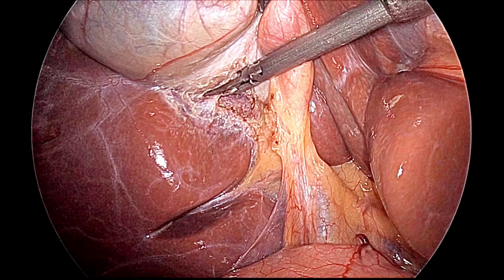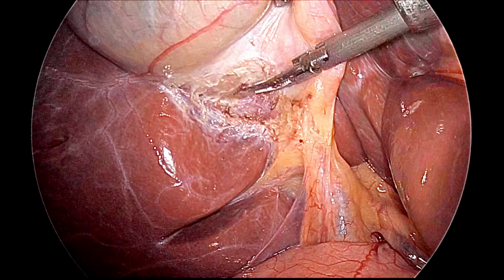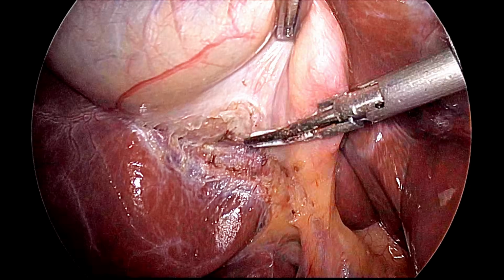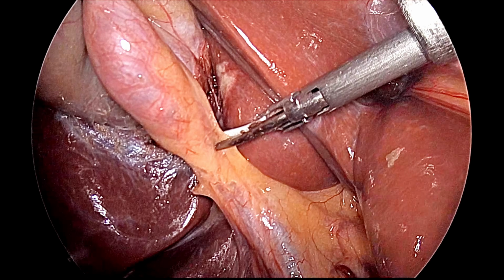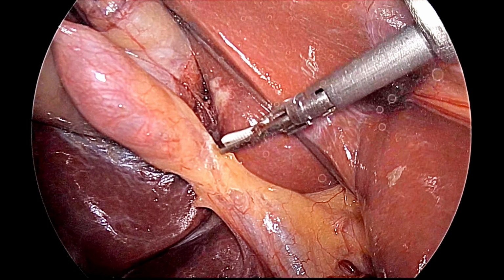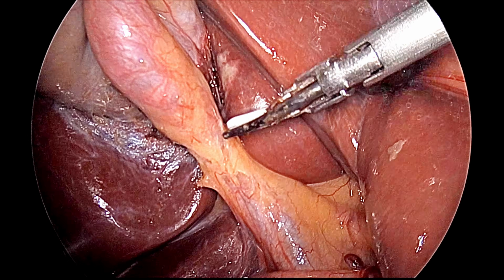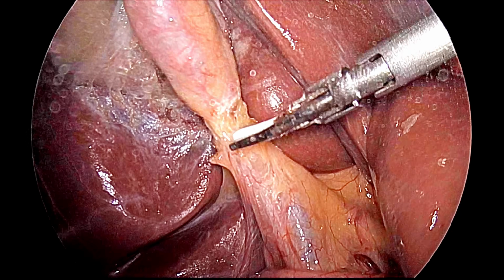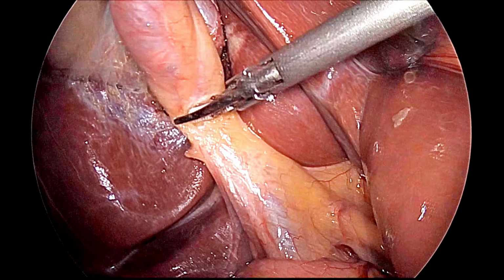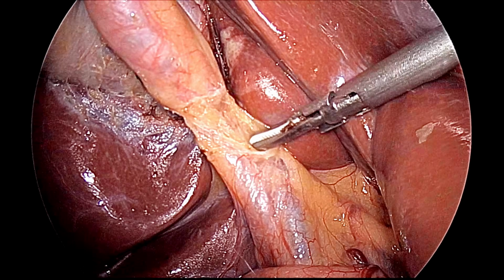We can see here the posterior window is formed and the cystic plate is getting enlarged. So, it is very important that you separate the peritoneum, because without cutting the peritoneum, if you try to separate the duct and artery, it will puncture. So, just a millimeter of the peritoneum should be held, and then bluntly you can push it down.